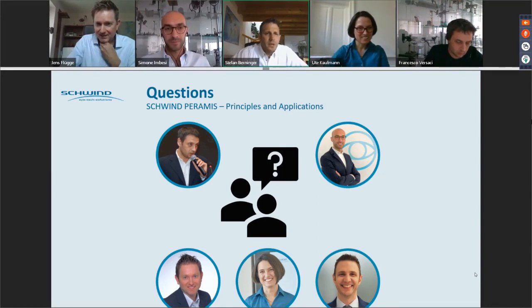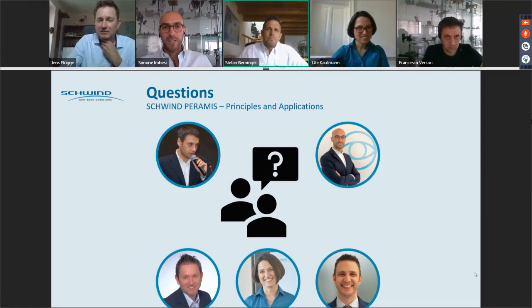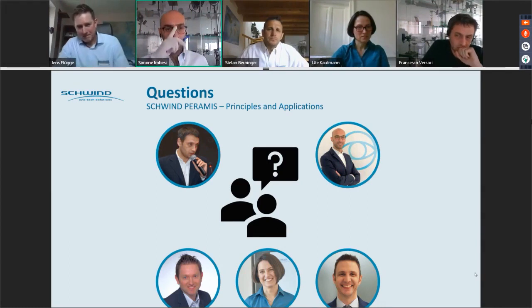So what is the ideal light condition in the room for a good exam? For sure, if we are talking about aberrometry, the preferred condition is the scotopic condition, because we can get a bigger pupil and get more information.